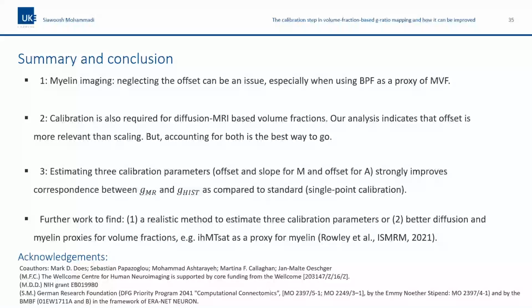I'm definitely not an expert on the exact biology that's going on, but technically what we're doing should be able to measure that whole myelination process early in development. There are always some methodological issues, such as whether myelin metrics are sensitive to axonal volume when you're completely demyelinated, which I think are open questions. But we should be able to follow this trajectory. There's been work by Dean and Dioni on looking at the developmental trajectory of the G ratio, for example, and it's a nice application of it, in fact.